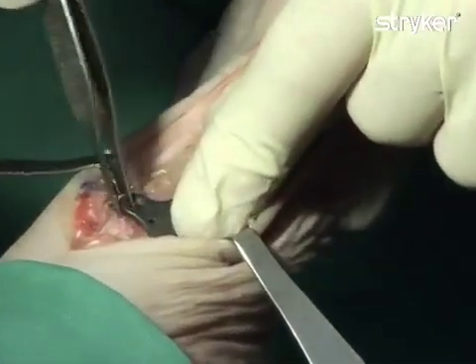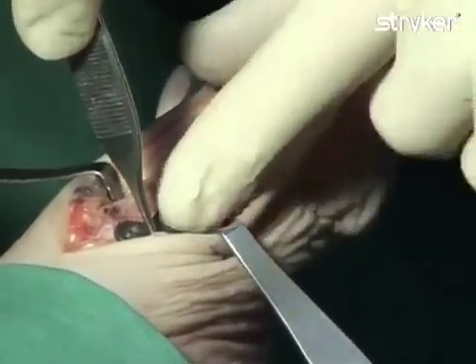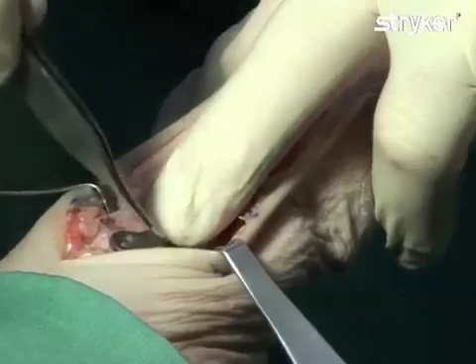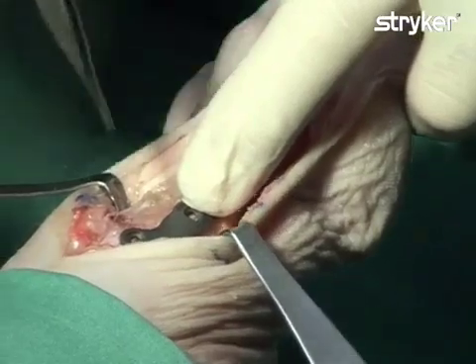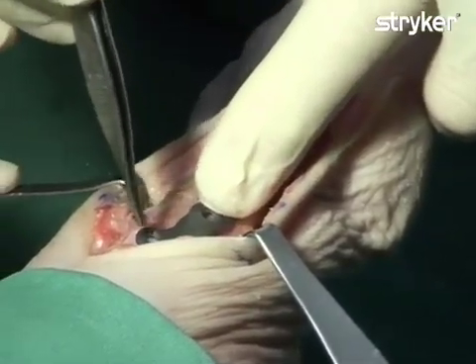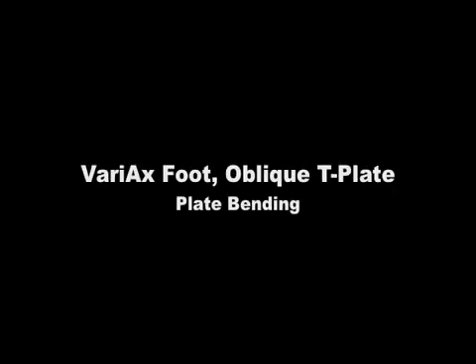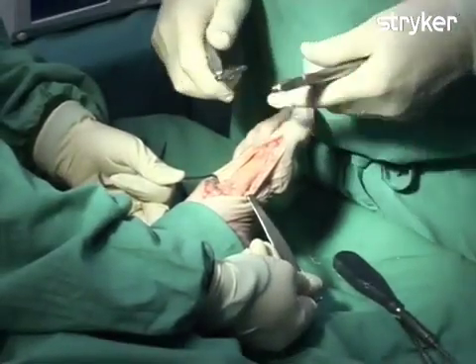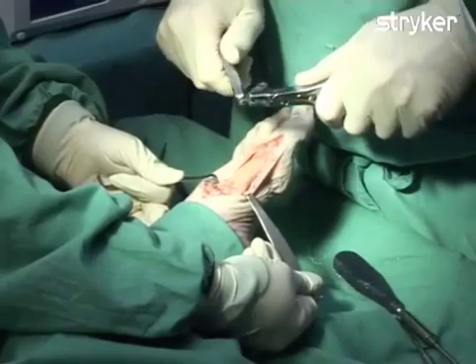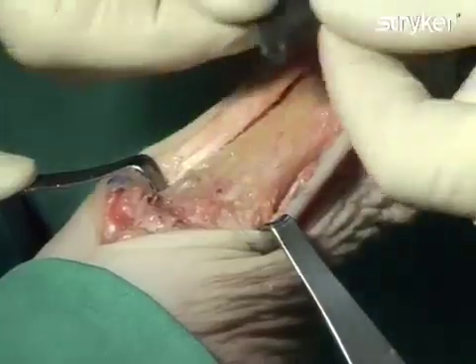The plate is then provisionally placed on bone, as plantar as possible. Bending of the dorsalmost aspect of the plate can be performed to further facilitate plate placement. When bending Variax Foot plates, it is important that the dedicated Variax Foot plate benders be used. The benders are designed to protect the locking holes of the plate during bending. The bent plate is then repositioned on bone.